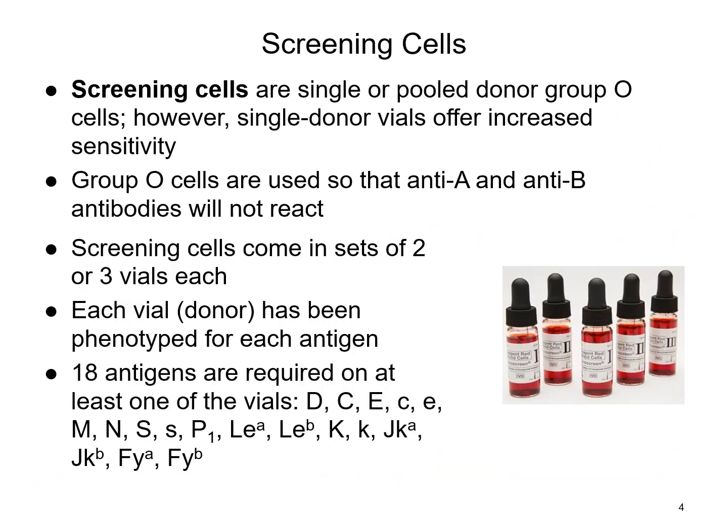Okay, so how do we determine if a patient does have an antibody? Well, of course, we've got to do some sort of screening to see if there are any antibodies present. To do that, we will do an antibody screen. Typically when a patient comes in and they need a workup for a transfusion reaction, or prenatal testing for a mom to determine her blood type and if she has any antibodies, or any testing for the possibility of a transfusion, then you're going to do that antibody screen.